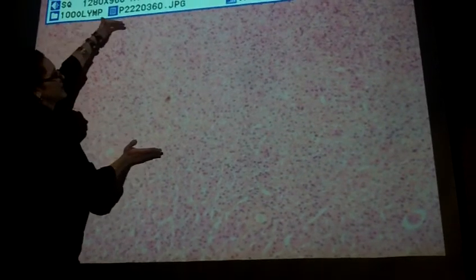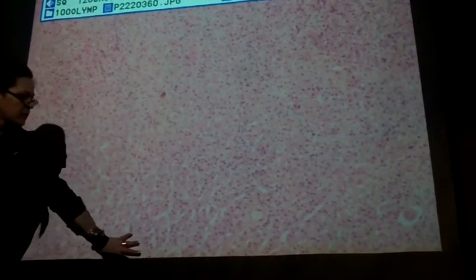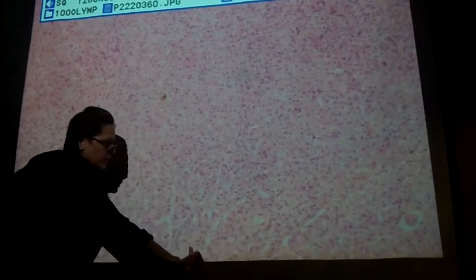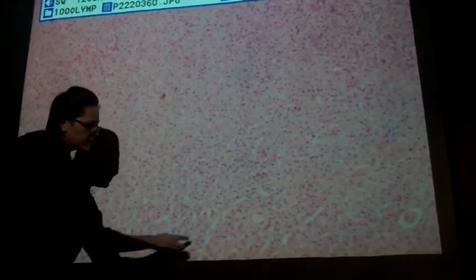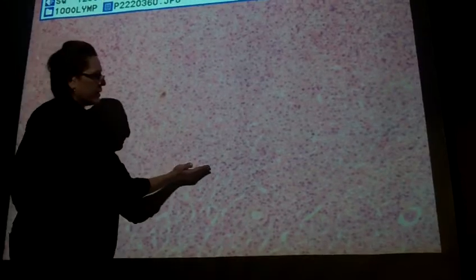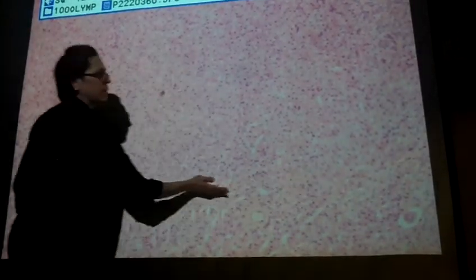This is all fasciculata in here. Down here, I know we're getting into reticularis because the cells are going at angles a little bit, and you see more white spaces in here. So I know we're getting into reticularis. The cutoff is probably right around there somewhere, kind of right in there. So fasciculata, reticularis. If we keep going.